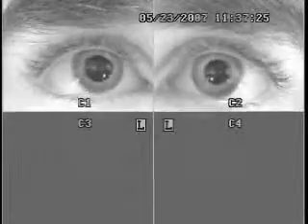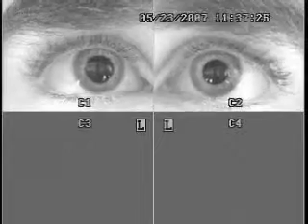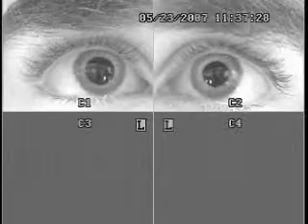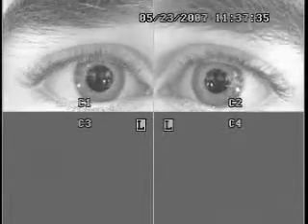And now we're going to check for vertical nystagmus. Just follow the bead as it moves up. There it goes again.